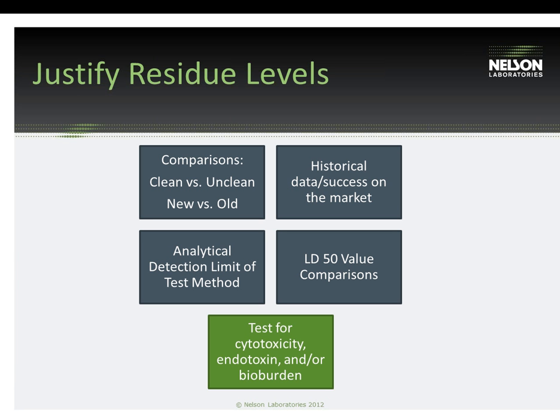We also see people compare the residue values from the extract to the analytical detection limits of the test methods. So again, these are the test methods for the analytical test that we just discussed. And some people will say if the extract values are less than the limit of detection of the test, well, I have a pretty clean device. We caution people here, however, that we want to make sure that you are examining enough of the device in the first place to examine residues if they were present.